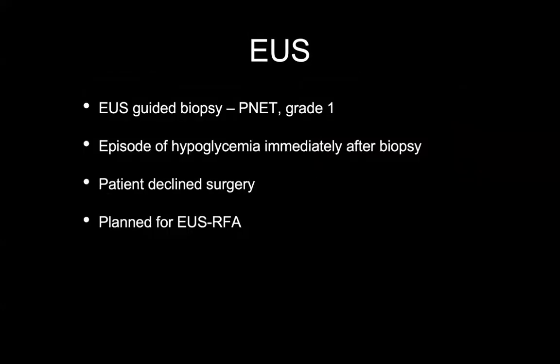The biopsy revealed a pancreatic neuroendocrine tumor, grade 1. This was an insulinoma, and the patient even developed an episode of hypoglycemia immediately after the biopsy. The patient had declined surgery and hence was planned for an EUS-guided radiofrequency ablation.